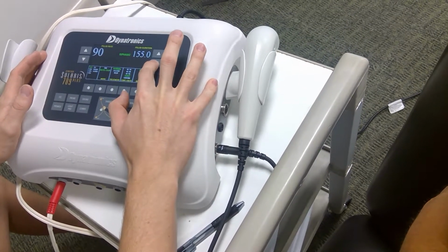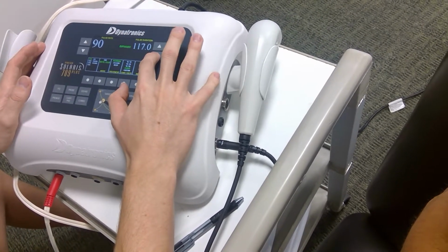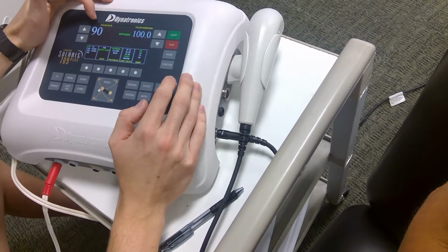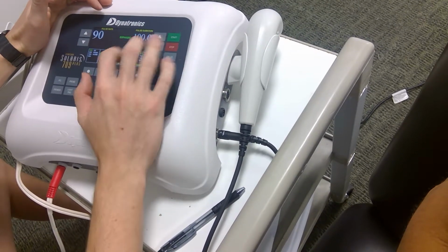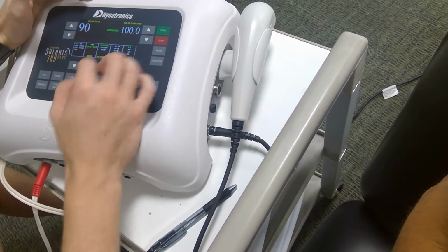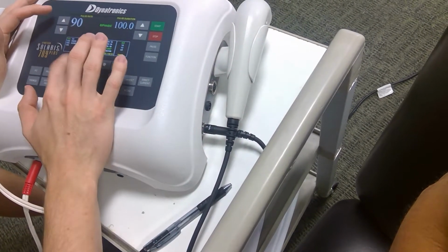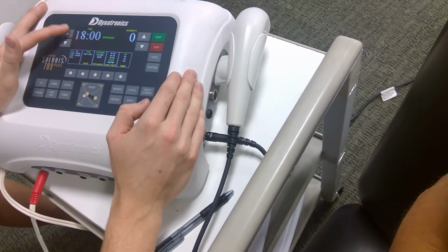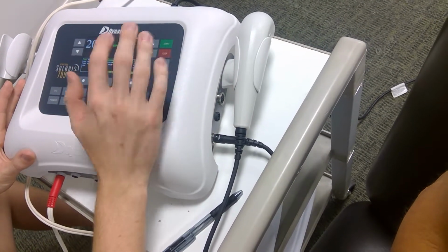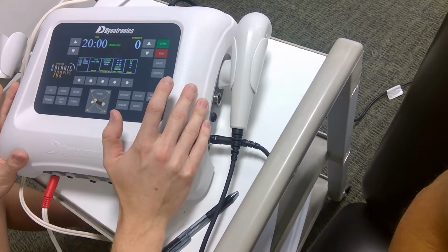Great. So I think when you started there, you'll feel that turn on, and I just want you to kick your leg up instead of stride. So there I'm set at a rate of 90 pulses per second, with a duration of each pulse being 100 microseconds. I'm still in a normal treatment type, no co-contractions or reciprocal, under continuous, and I have a ramp time of 0.5. Then I'm going to bump my treatment time up to 20 minutes here. And then the intensity: I'm going to first put the pads on the patient, and then I'm going to increase the intensity until the patient is comfortable with a light tingling sensation over the concerned area.